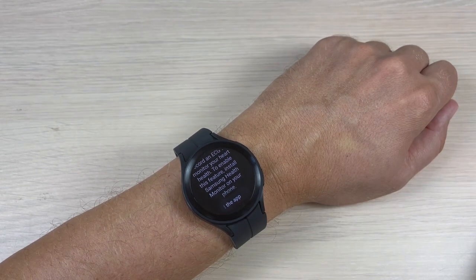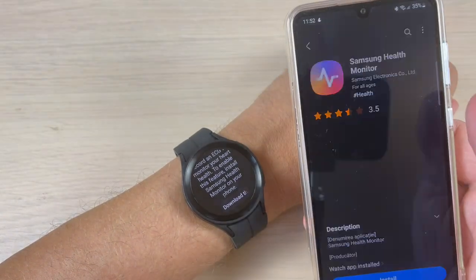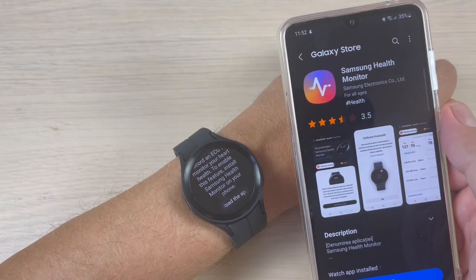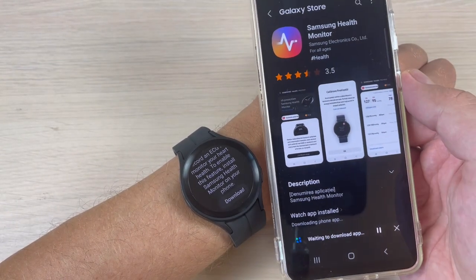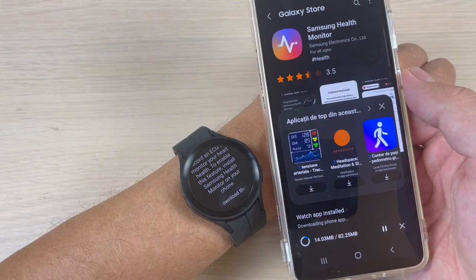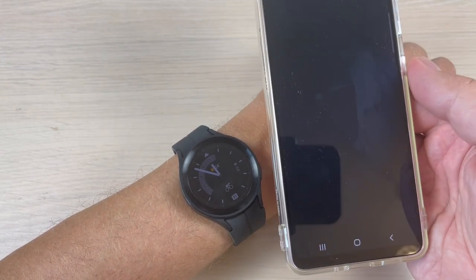On my phone the app will be downloaded. Now just press 'Install', wait for a few seconds, and now just press 'Open'.